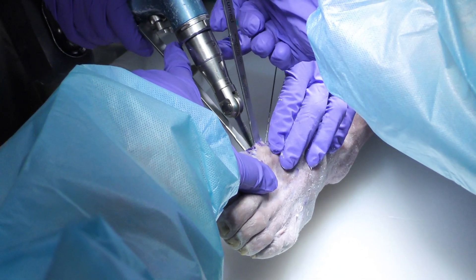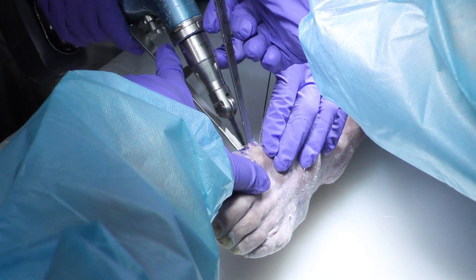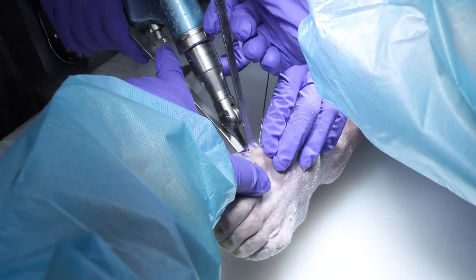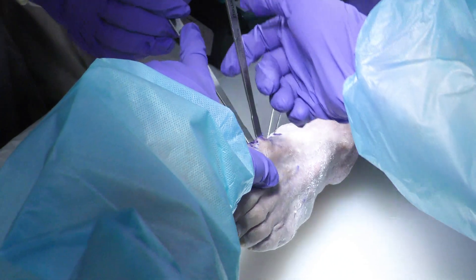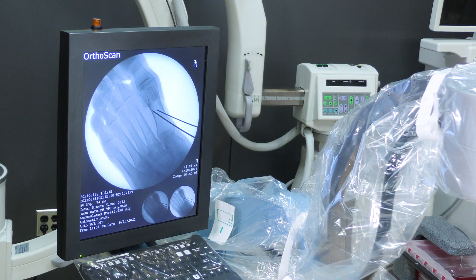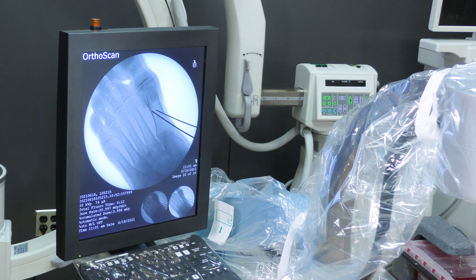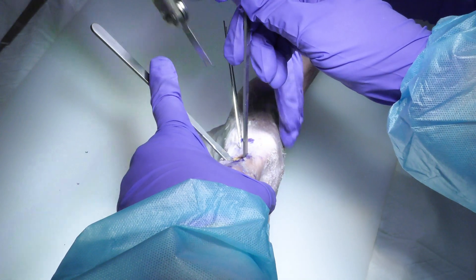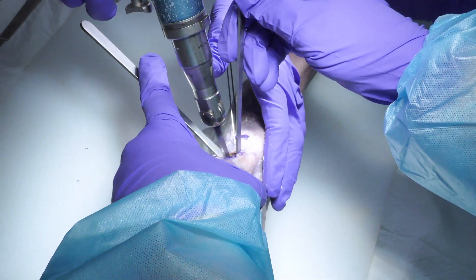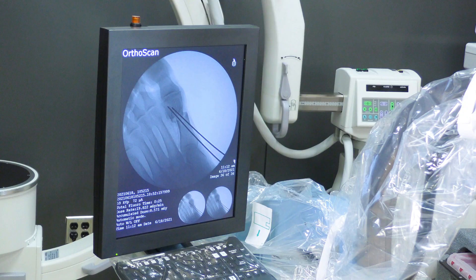Before I complete the cut, I take an x-ray to make sure I like that spot. I like that trajectory — we're behind the sesamoids, we're rather horizontal. You can either be slightly horizontal or drop your hand backwards to push the saw a little bit more distally to allow for a little bit of length if you so desire. Then we complete the cut; the osteotomy is complete.